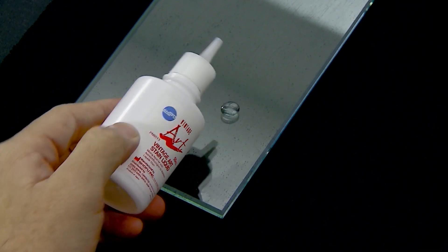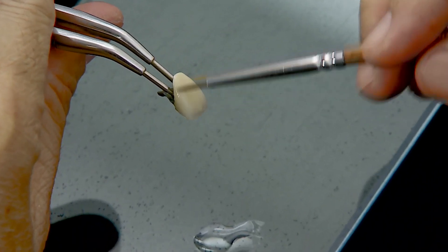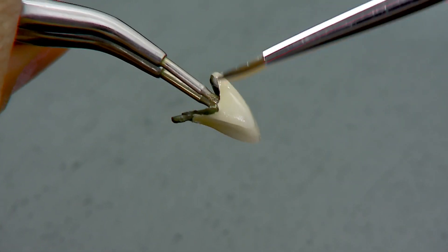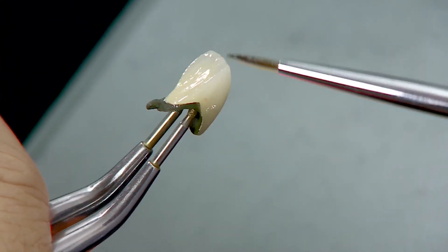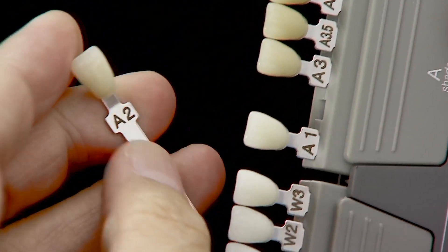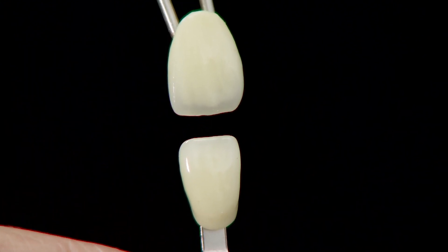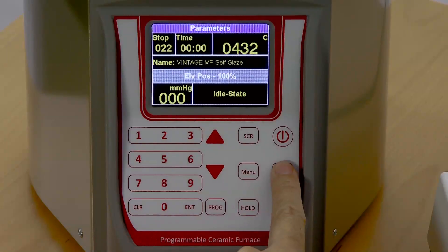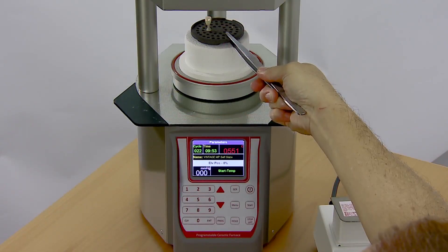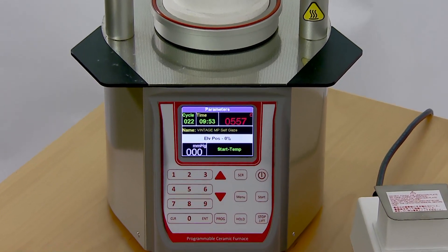Rinse the crown before staining. Dispense a few drops of Vintage Art Stain liquid onto the glass slab and apply a thin layer on the crown surface. Use the shade guide to compare the shade of the final restoration. Vintage Art Stain can be applied to further enhance the tooth color. If staining is necessary for the cervical area, use orange stain. Apply brown or orange-brown in the proximal area. Finally, glaze and fire the stained restoration.